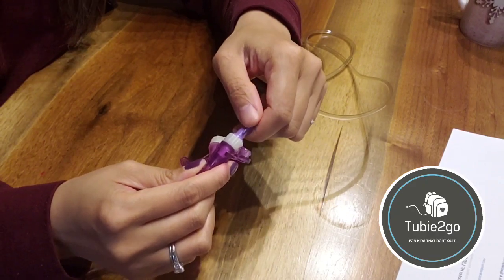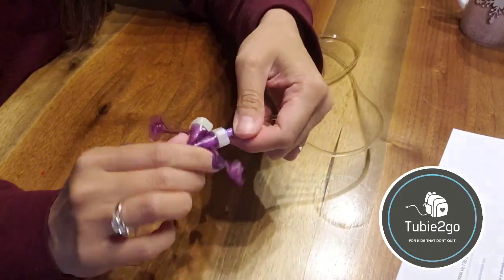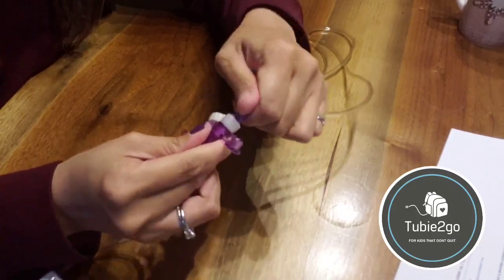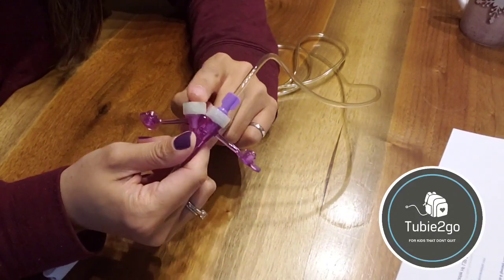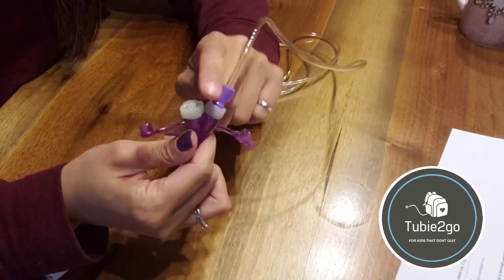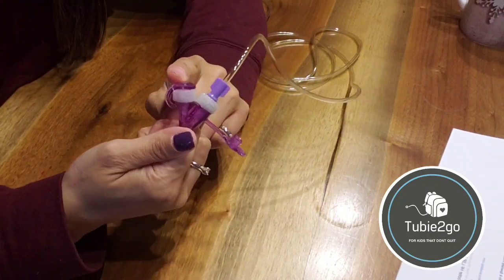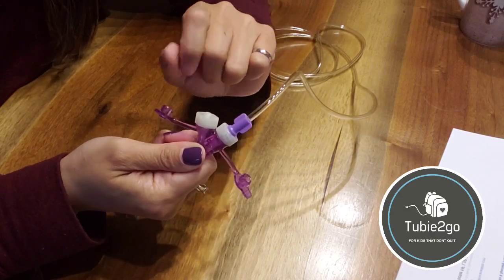So this is going to be your most reliable solution for disconnecting ports, unless your little one manages to have the fine motor skills to actually unscrew it with several twisting motions. Another issue that I've heard flagged with the ENFit connectors is if you have this continuous feed extension set with the two ends, this cap that is meant to be stuck on the end of the ENFit connector here may still pop off and end up feeding the bed.